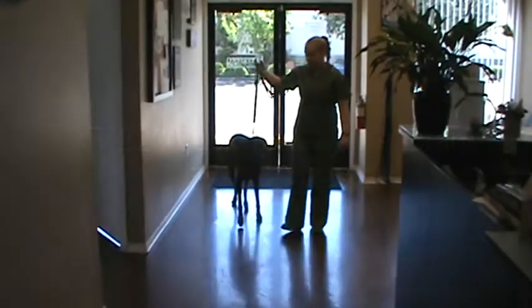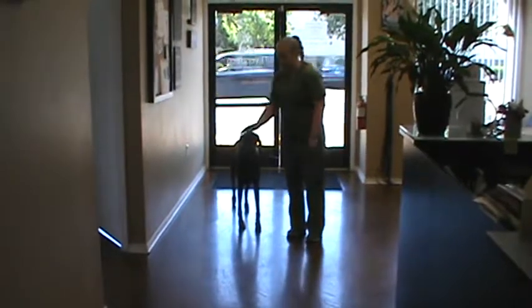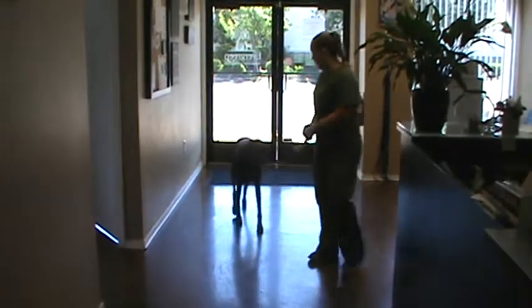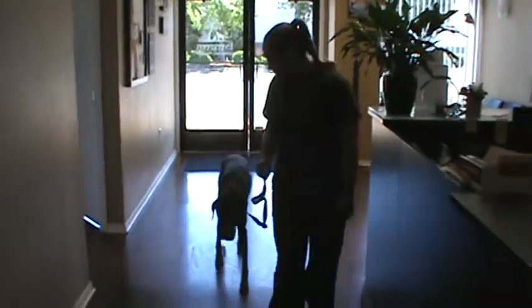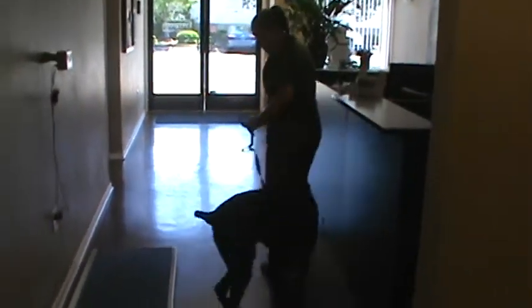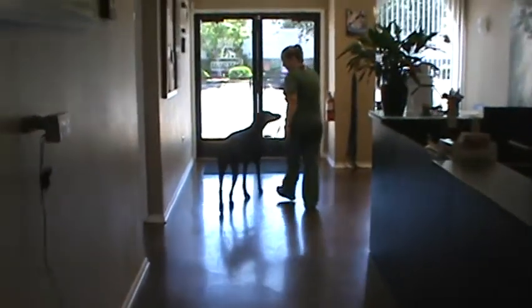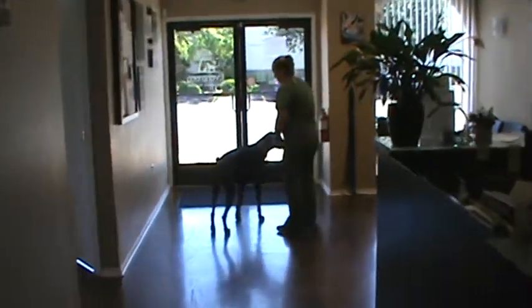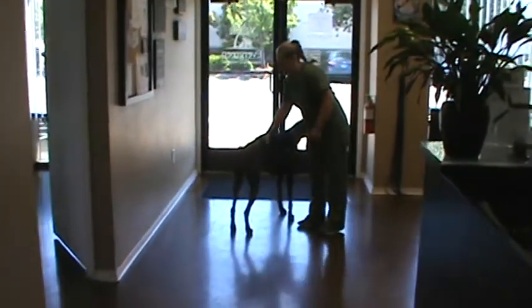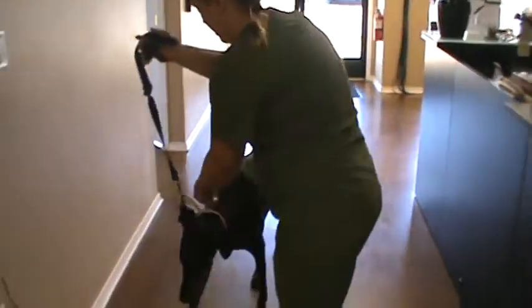This is Chelsea for VETT 220, Test 15, which is a canine exam. We're going to go ahead and assess our patient's gait and her body condition. Okay, so her gait looks good and her body condition score is lean to thin, so I would give her a 4 to 5. And then we're going to go ahead and get on the scale here.